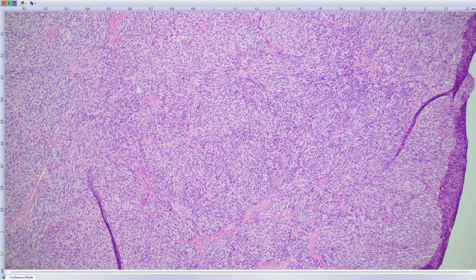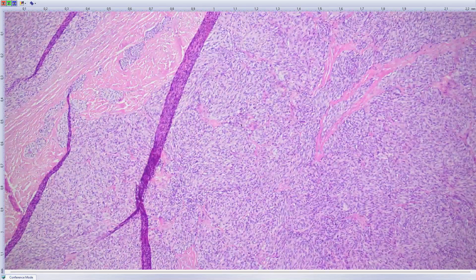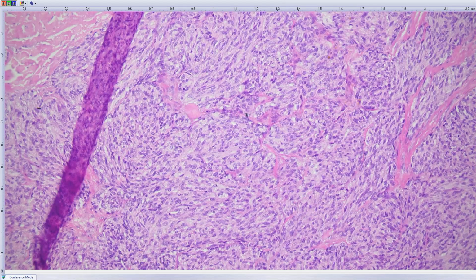So once more, this is a nested morphology. It's called clear cell sarcoma, but the cells are usually not clear. They are more commonly eosinophilic, such as here.